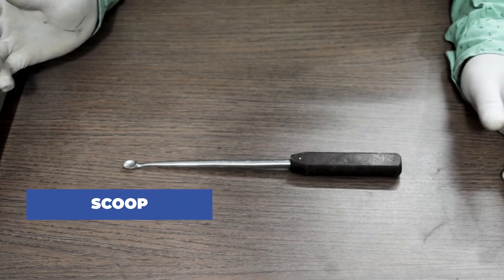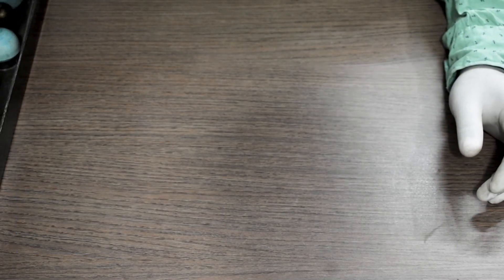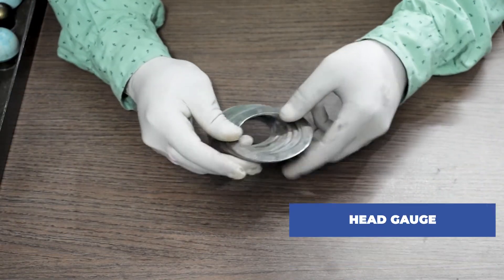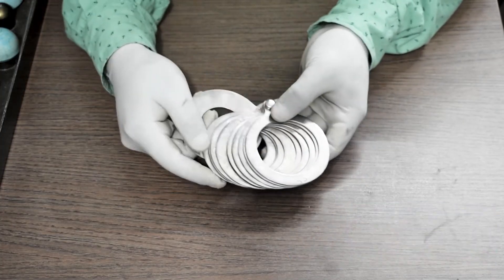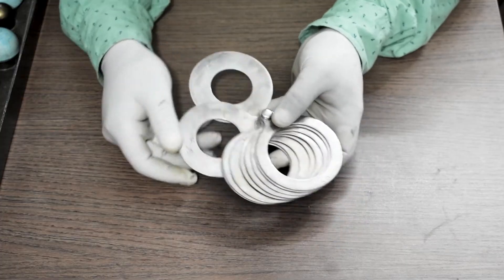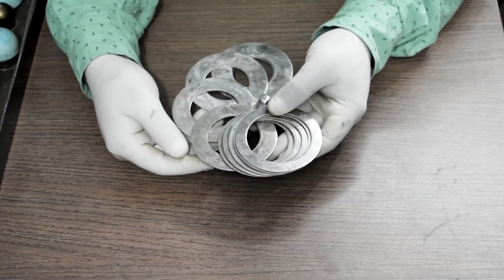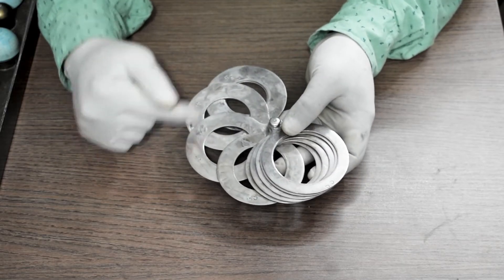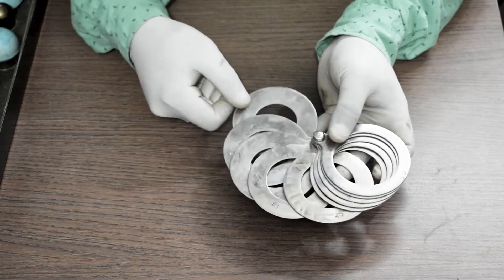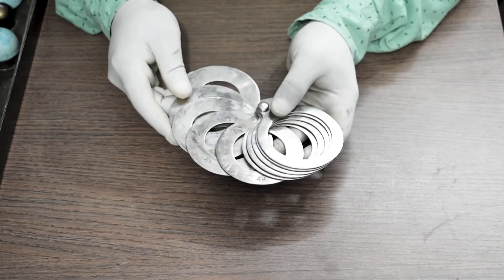This is called a scoop. These are called head gauges. They come with a 2 mm difference in between, starting from 37 mm, 39 mm, 41 mm, 43 mm, 45 mm, and so on till 55 mm.